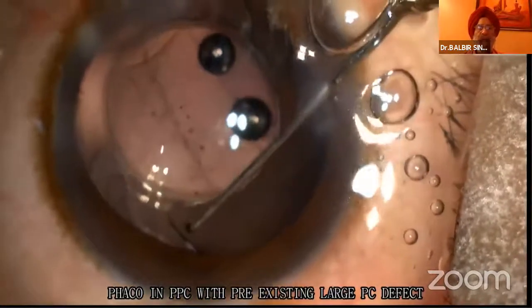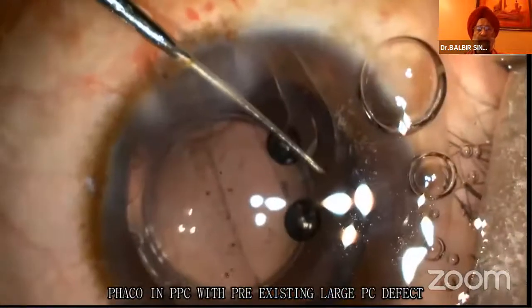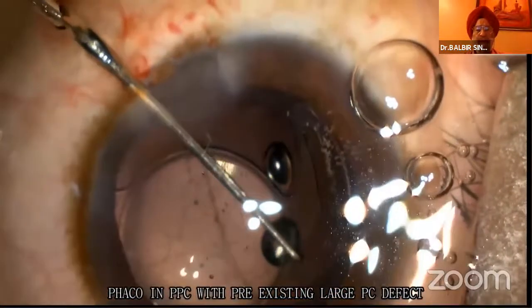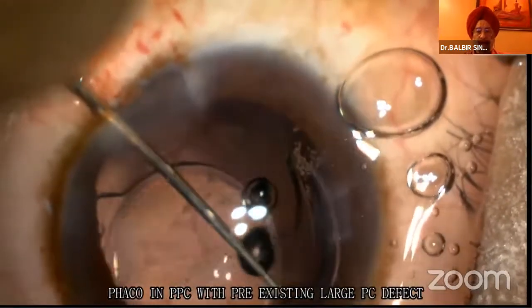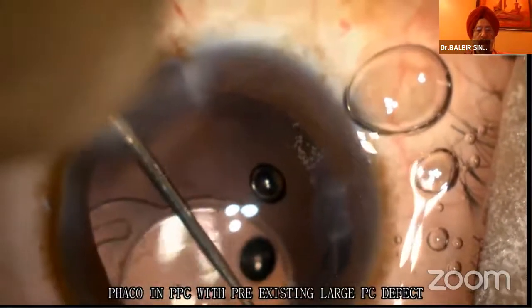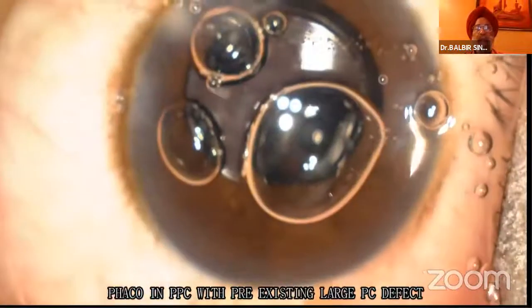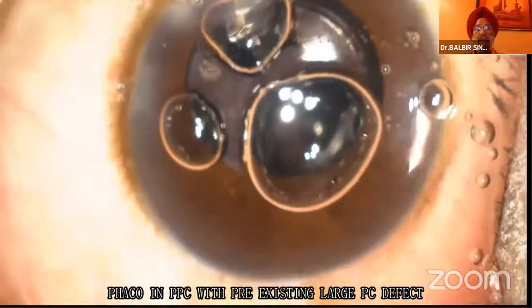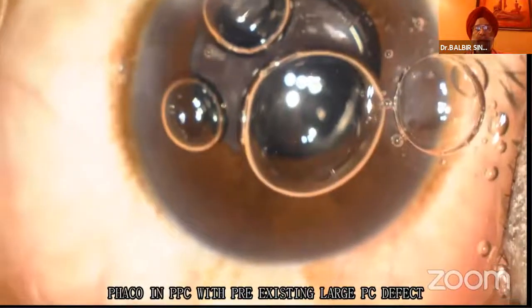The vitreous did not present much into the AC, but I did an anterior vitrectomy and confirmed with triamcinolone. The postoperative results were extremely good.